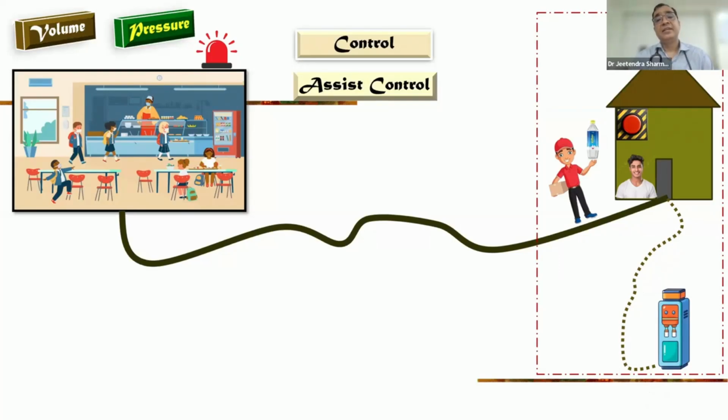And they say your 3 bottles in the first agreement are at 6 a.m., 2 p.m., 10 p.m. This bell will still work, but what I will do is that all the time this bell will not work. One hour before, I will activate this bell. Activate means I allow it. Before that, even if you trigger, the bell will not work. So this alarm bell will be activated 1 hour prior to the expected delivery.